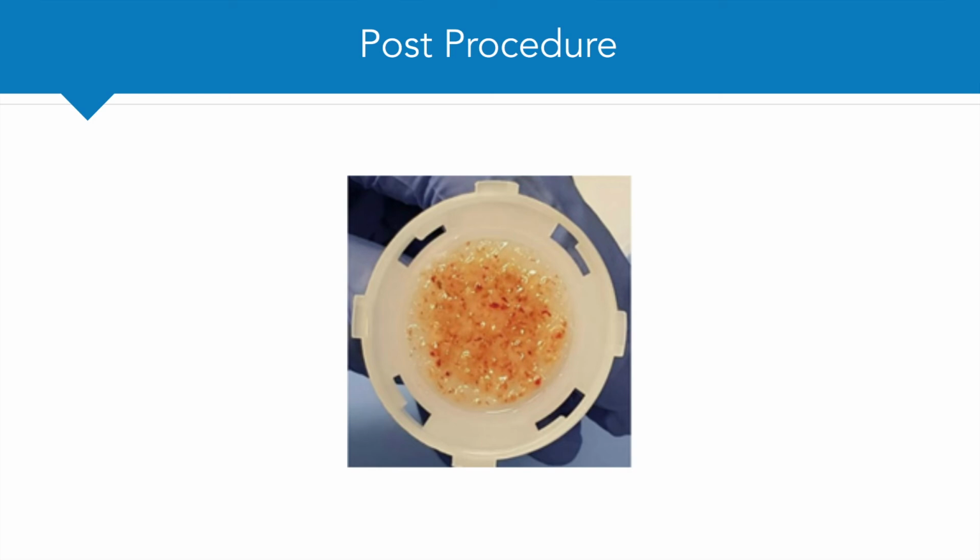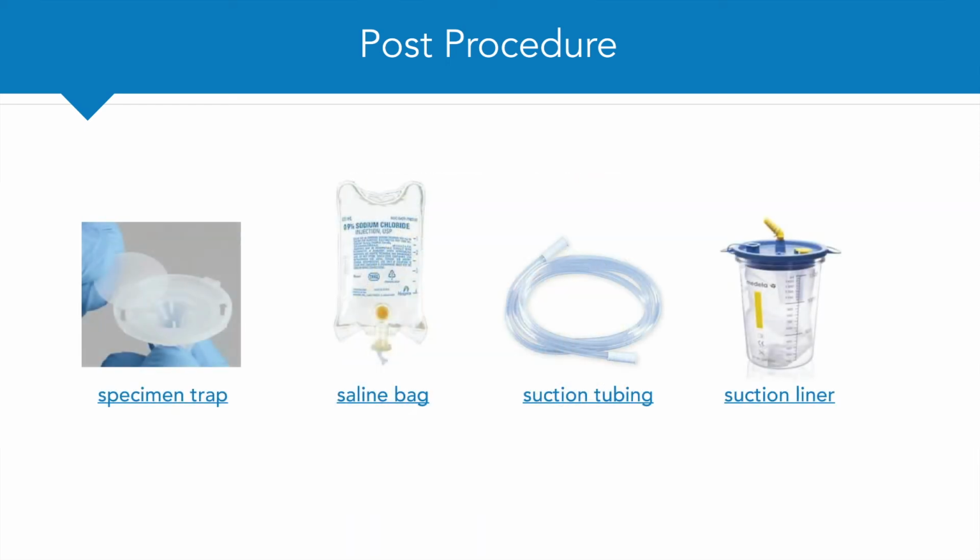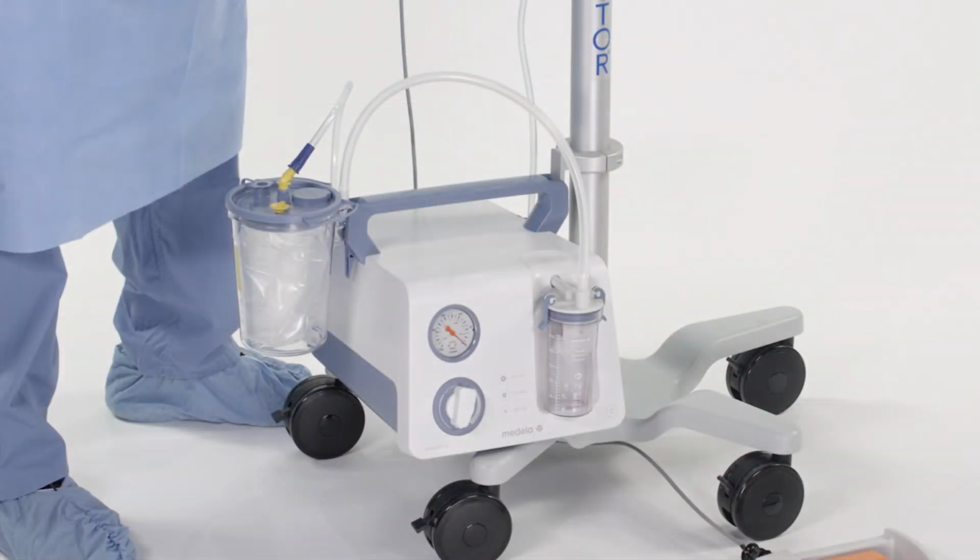Place the filter into a plastic container containing formalin or tissue fixation solution. Discard all disposable components upon completion of the procedure. Do not discard the reusable plastic canister, vacuum overflow canister, and attached short reusable tubing.